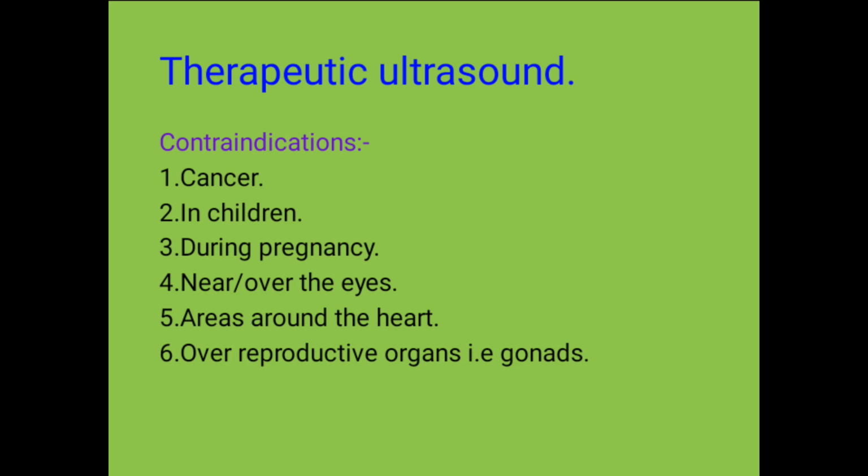And during pregnancy, it is again a contraindication because it will increase mitotic division of the fetal cells, which might result in unwanted conditions or malformations, which we call anomalies in embryology. And ultrasound should not be used near or over the eyes. This is because it will damage the retina and even the eye lens.